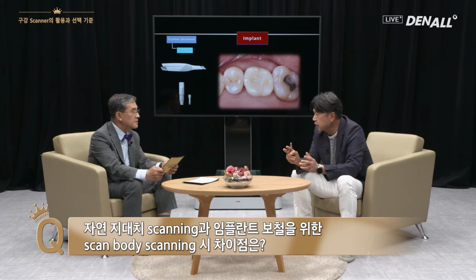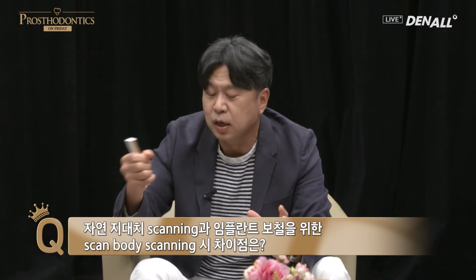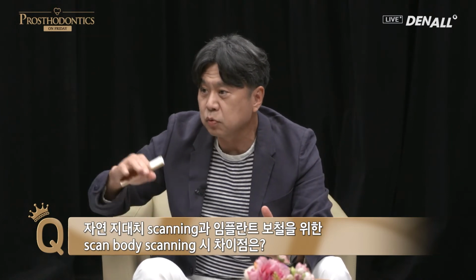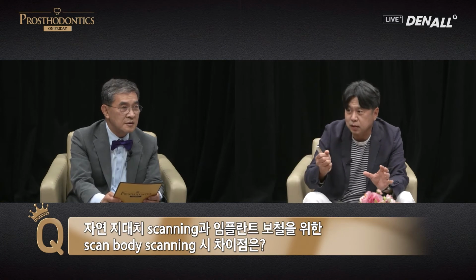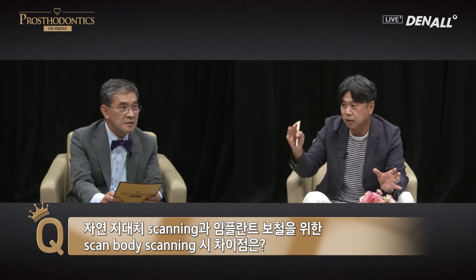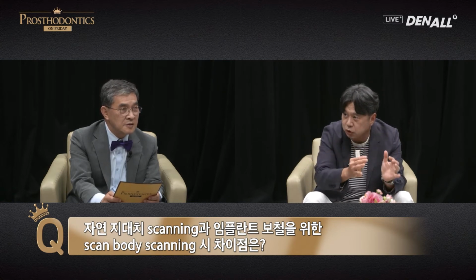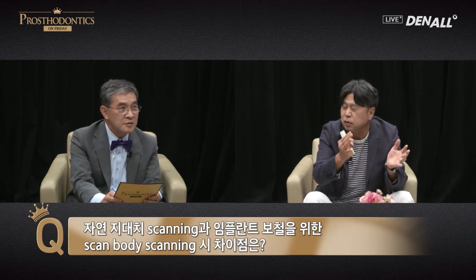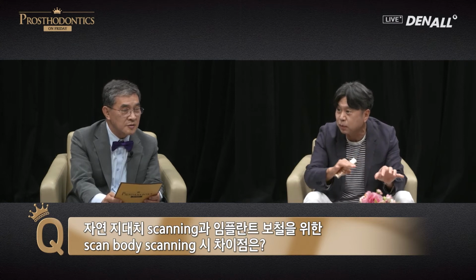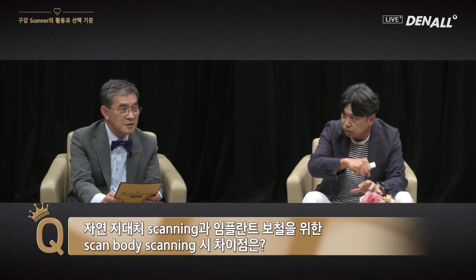The biggest difference is that natural tooth scanning is done after complete preparation. After scanning, crown designing is the next stage and the model is not changed. The completed preparation is scanned. For implant scanning, after the scanning, the shape is made. So natural tooth scanning is covering shape and the positions. Implant scanning does not cover the shape, only the positional relations, which is much easier.